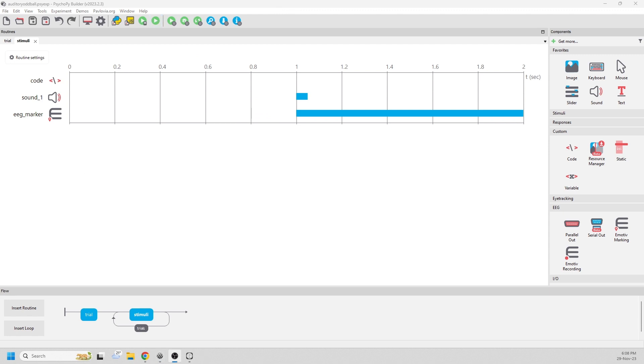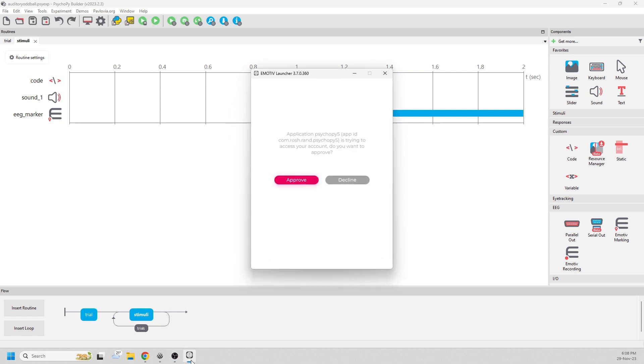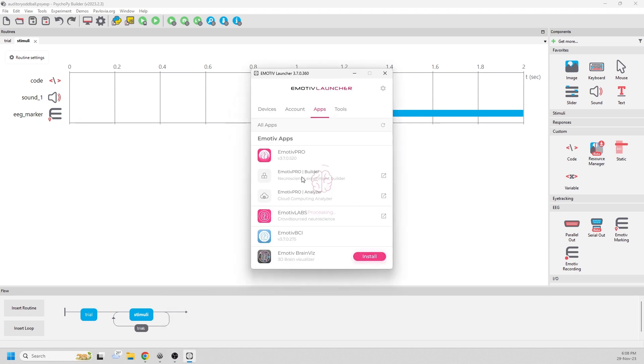The first time you try to run the experiment, it will fail. That's because you have to go into your launcher and approve it to connect the first time. You won't need to do this again for the next experiments.